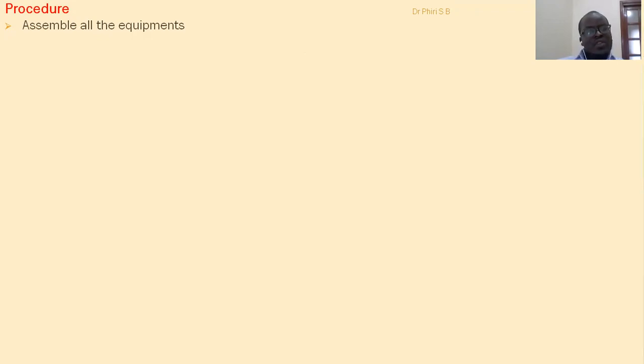And sometimes you can also add a counter that you use to count red blood cells. As you are counting manually, you just press that counter, and it will give you the recording of the total blood cells that you are going to count. As you are seeing here, you just press that. It will tell the number of cells that you count on the slide and what you record on the counter.